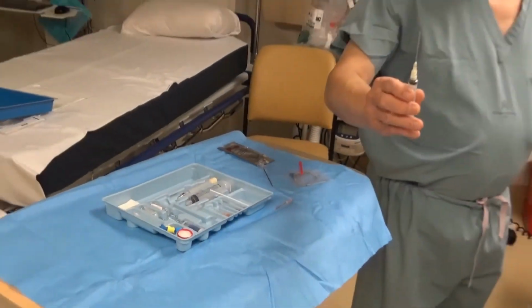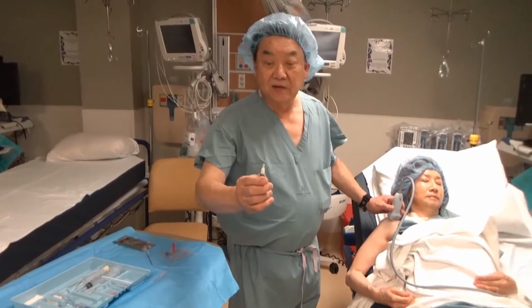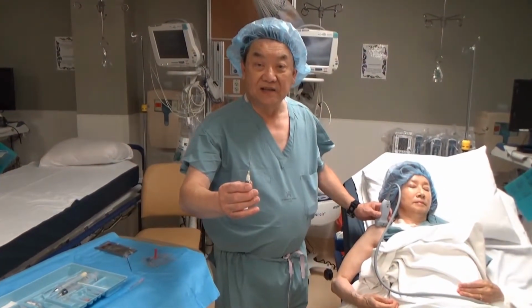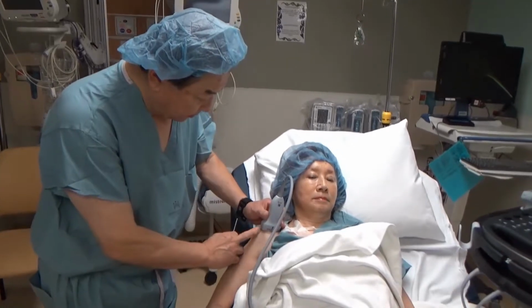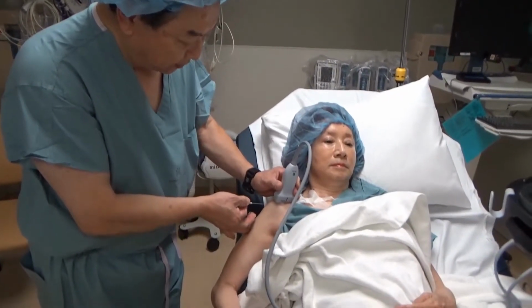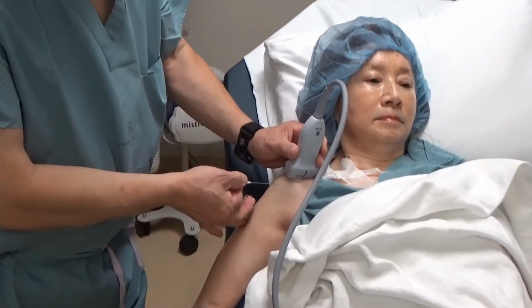I have here a hypodermic needle which is blunted, and we will then demonstrate how we will anesthetize the skin. So we see the image, and then we simply have the needle placed parallel to the beam, and we will then anesthetize the skin.